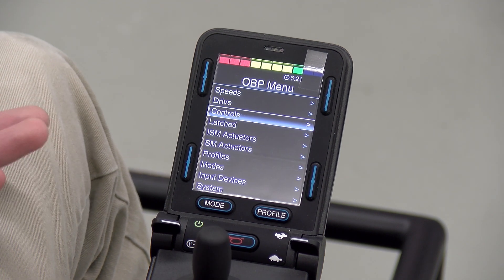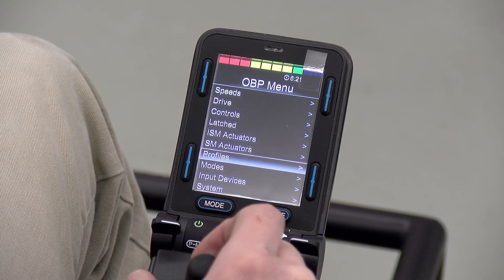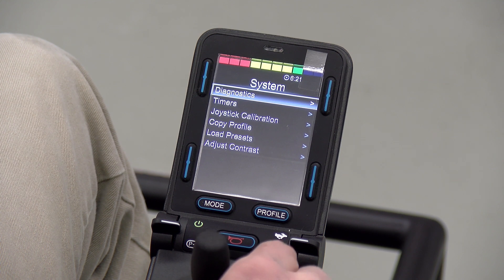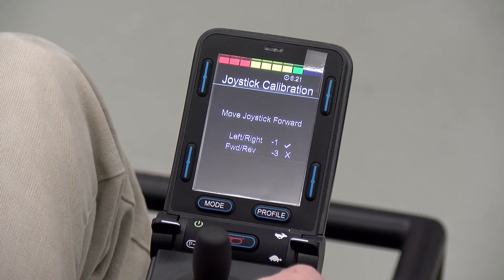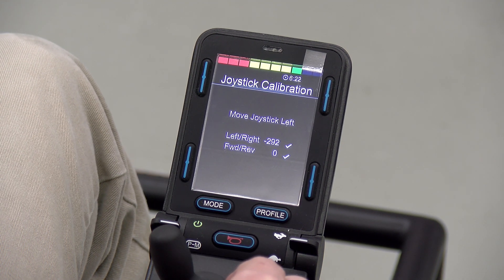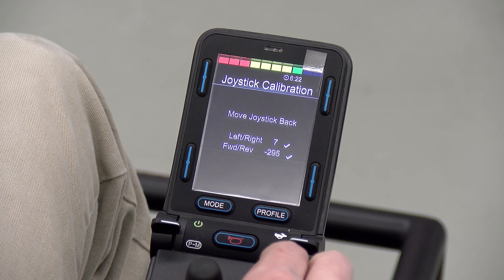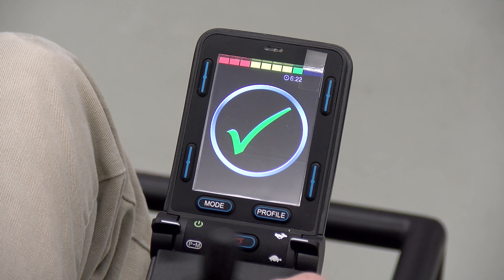The last thing we're going to touch on is joystick calibration. If you go all the way down to the bottom of the programming menu, click on system and there you should find joystick calibration. It will run you through a prompt where you have to push the joystick forward, left, backwards, and right, and after that's completed the calibration process is done. If your chair is slightly drifting off into one direction while trying to go in a straight line, or if you ever install a new joystick, it's always a good idea to run the calibration afterwards.